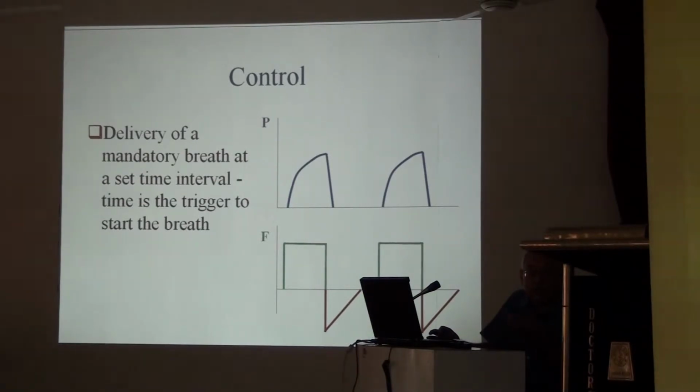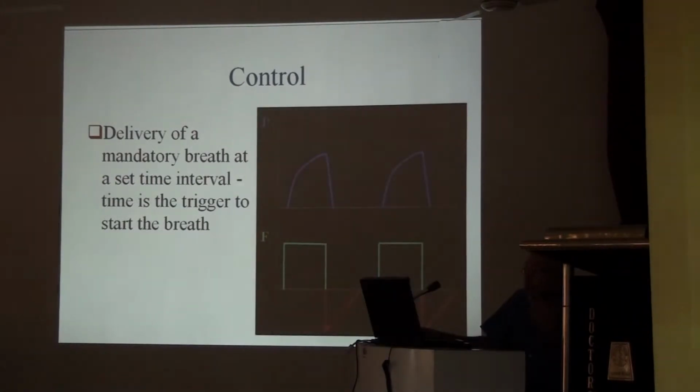But if your machine doesn't have a display arrangement, you have to be very careful in the clinic. You must watch the movement of the hand, apply the stethoscope, and look at the patient's chest wall, but it requires some training.